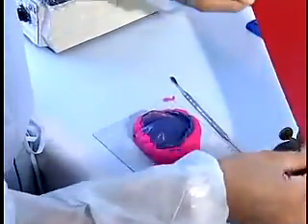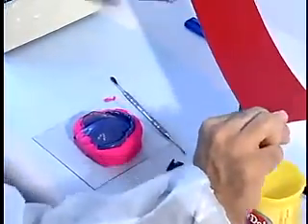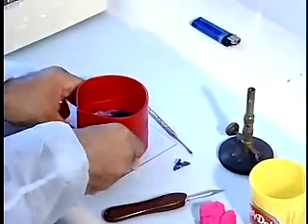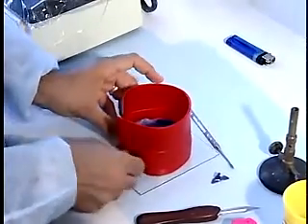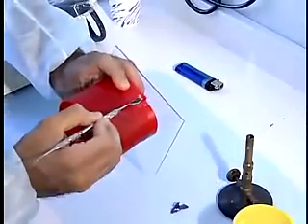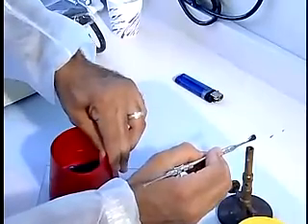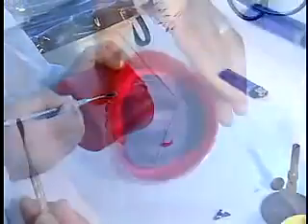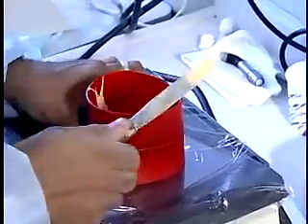Wrap a strip of boxing wax around the Play-Doh. Seal it with a hot wax spatula. The advantages of using this technique are its speed and ease of use.